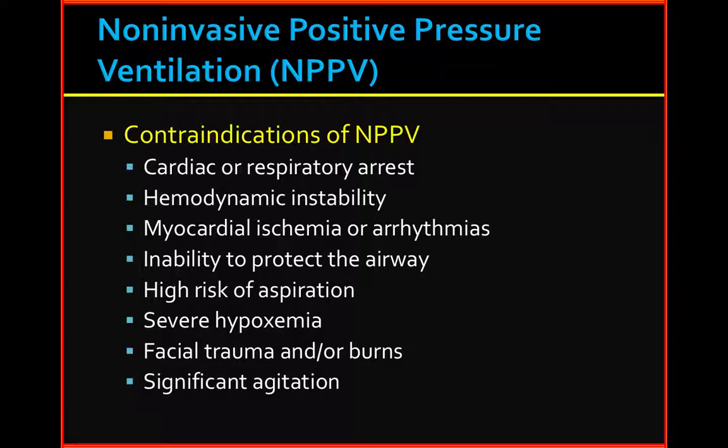every little breath that they take on their own will not get the full 500 cc's like you saw in assist control, but will rather be supported by a touch of pressure support, a little bit of a boost like they said. But they will control how much volume, their tidal volume, on those extra breaths on their own. They will still always continue to get the 10 breaths that are 500 cc's, but that's the difference. They're not getting a full 500 here.